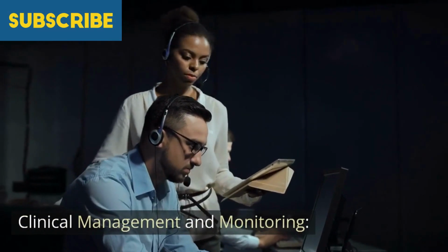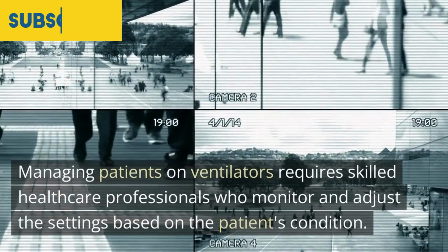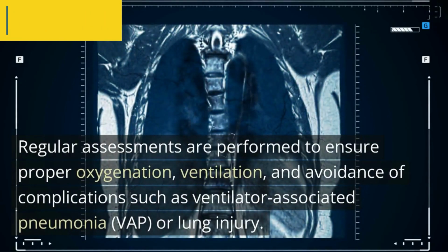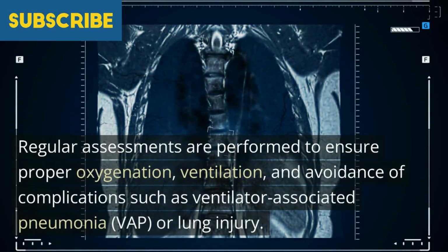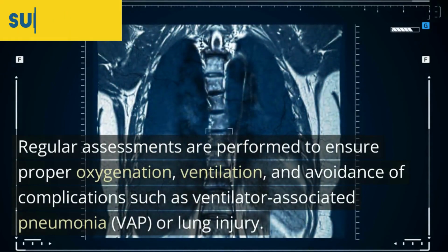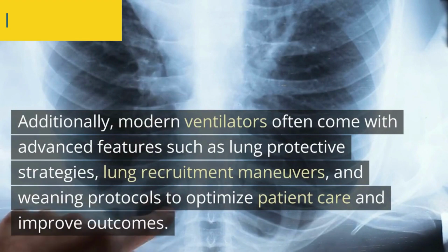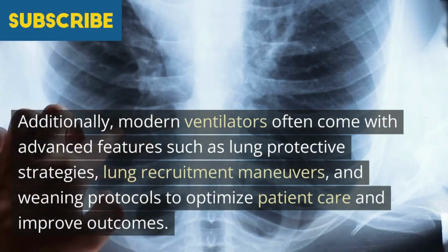Clinical management and monitoring. Managing patients on ventilators requires skilled healthcare professionals who monitor and adjust the settings based on the patient's condition. Regular assessments are performed to ensure proper oxygenation, ventilation, and avoidance of complications such as ventilator-associated pneumonia, VAP, or lung injury. Additionally, modern ventilators often come with advanced features such as lung protective strategies, lung recruitment maneuvers, and weaning protocols to optimize patient care and improve outcomes.